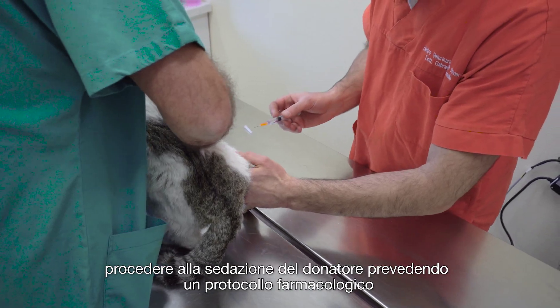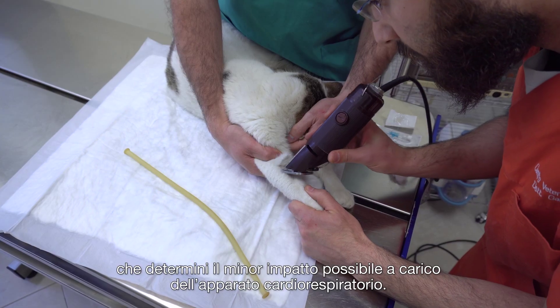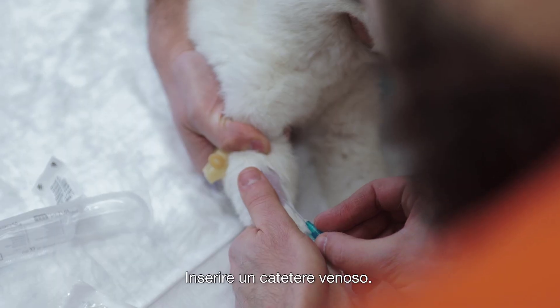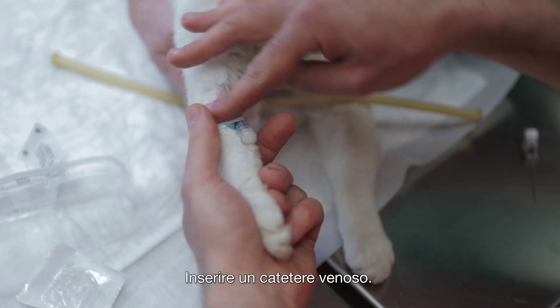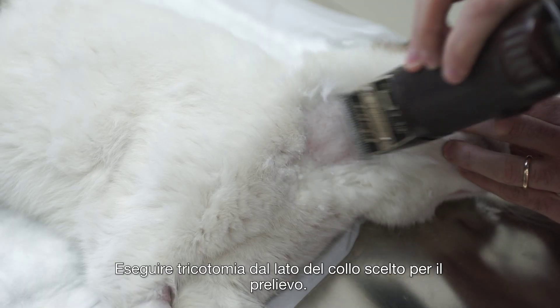Proceed with the donor sedation using an appropriate pharmacological protocol, giving the least depression for the cat's respiratory apparatus. Insert a venous catheter. Shave the area over the jugular vein of the chosen side for donation.